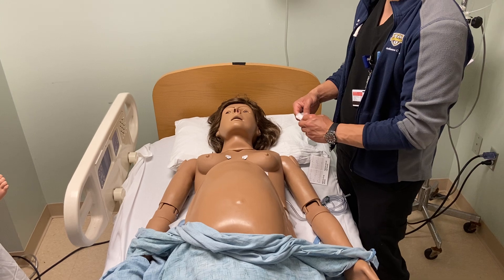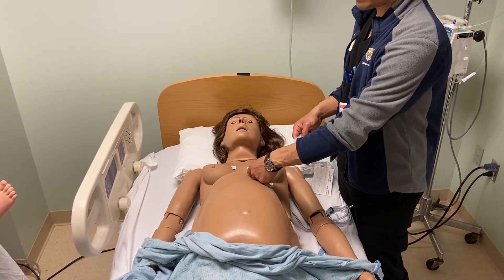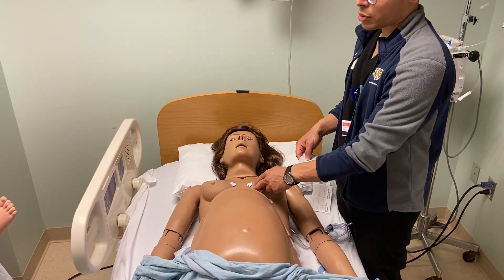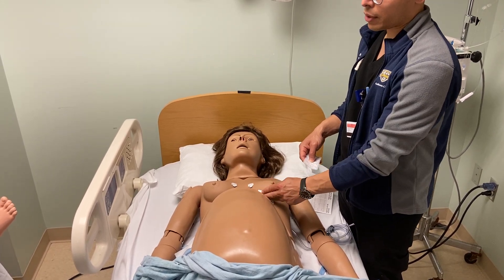V3 will go in between those. If you need to lift up the breast just to put it in the right midway position, you can do that also along the inframammary crease.